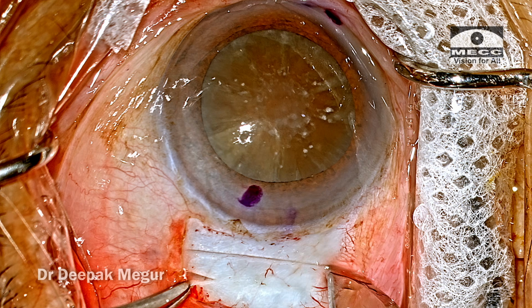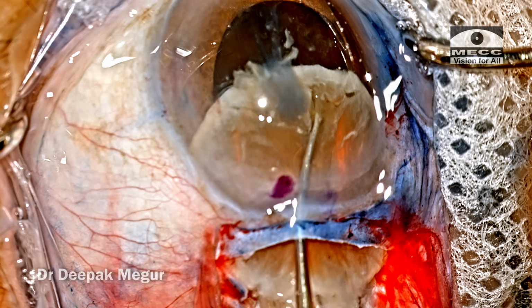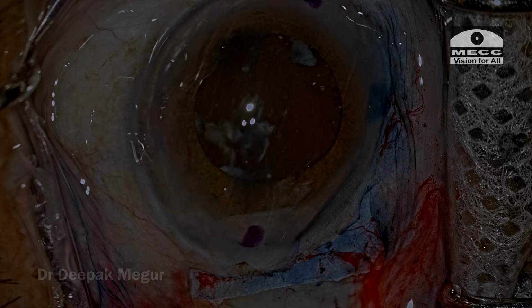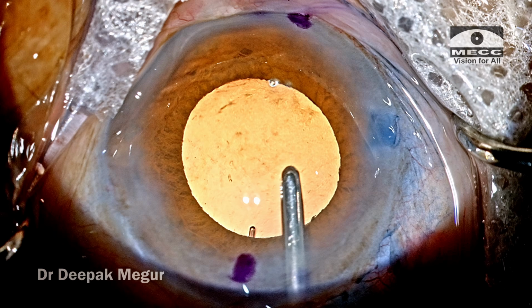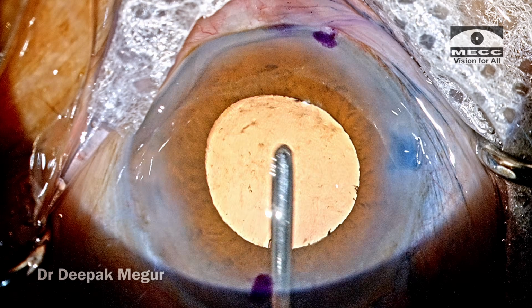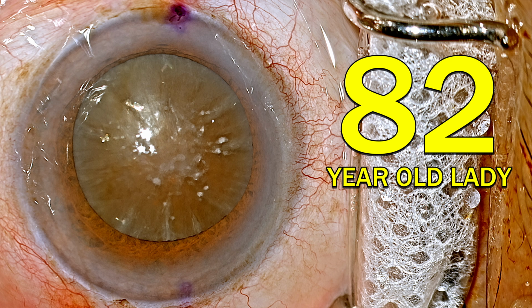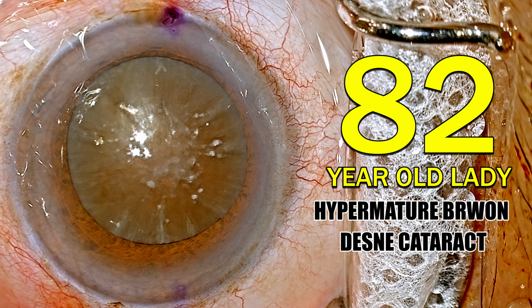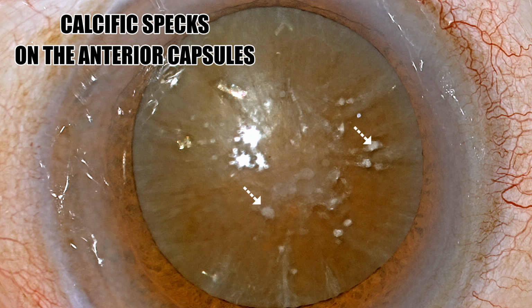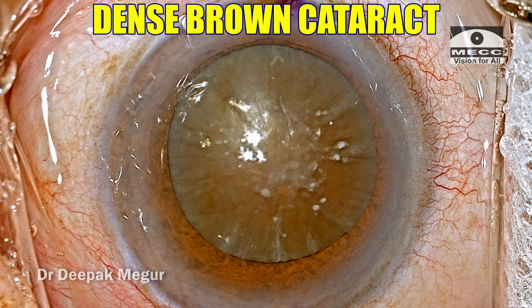In this video, we'll see how I performed a manual small incision cataract surgery by choice and put in a toric intraocular lens implant in a patient who had a very dense cataract with questionable zonular health. So she is an 82-year-old frail lady who has this hypermature cataract. We can see the calcific specks on the endocapsule. The underlying nucleus seems to be very dense.